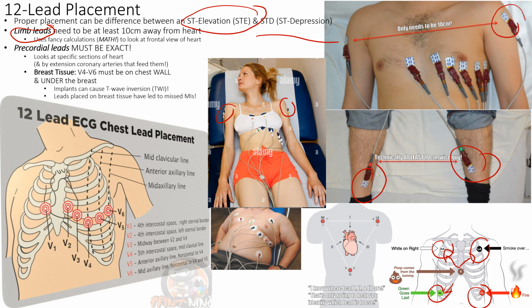So your black one, your white one, and you can listen to like smoke over fire, whatever gets you accustomed to where it should be placed. And then I have to remember it's white on right, because I was listening to some things. I was like, "Is the white is right?" It's like, no, that's racist. You can't say that. So it's white on the right side, right?